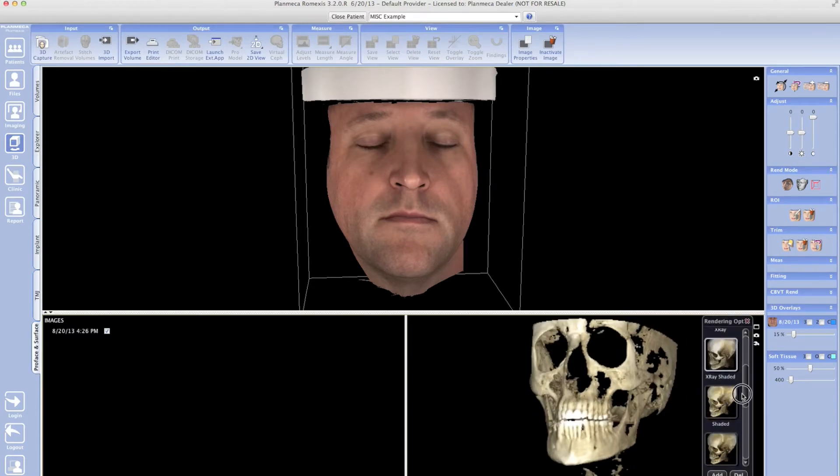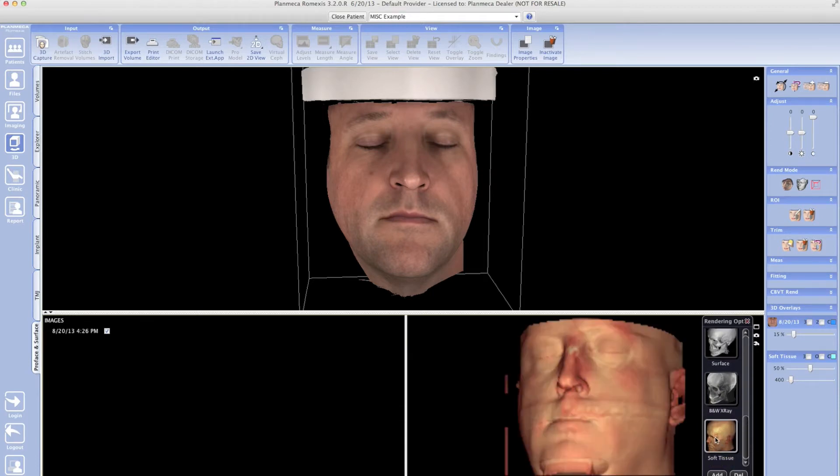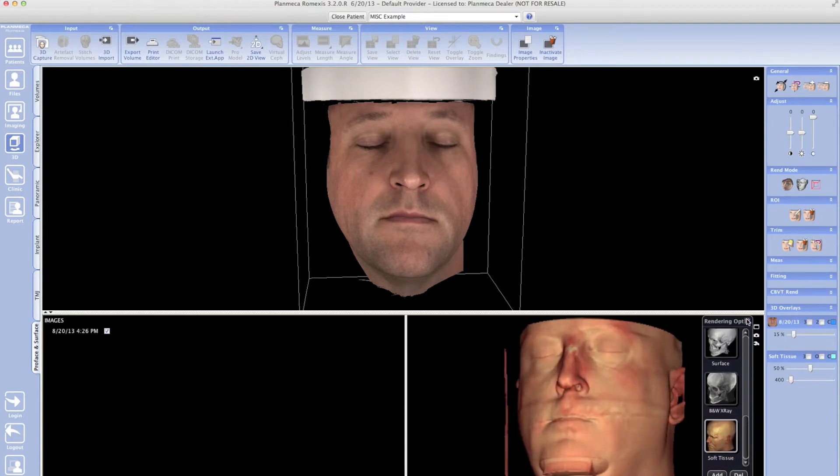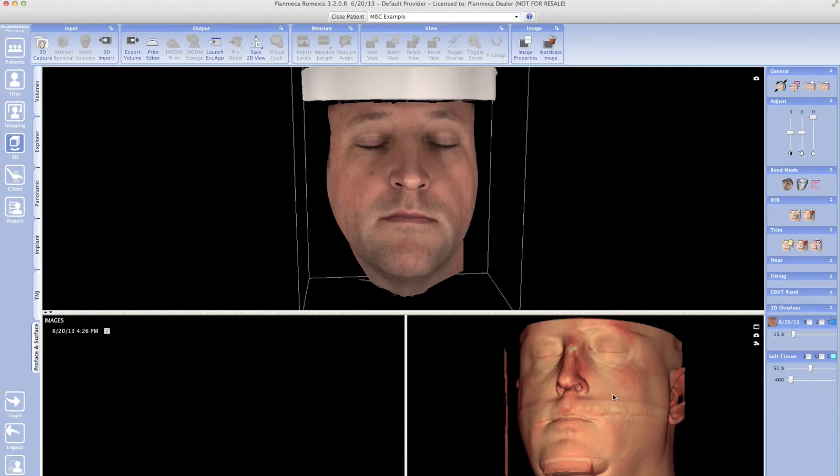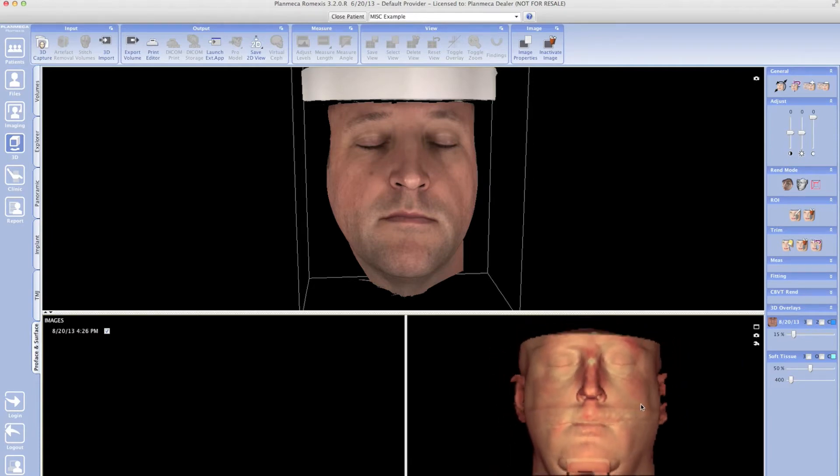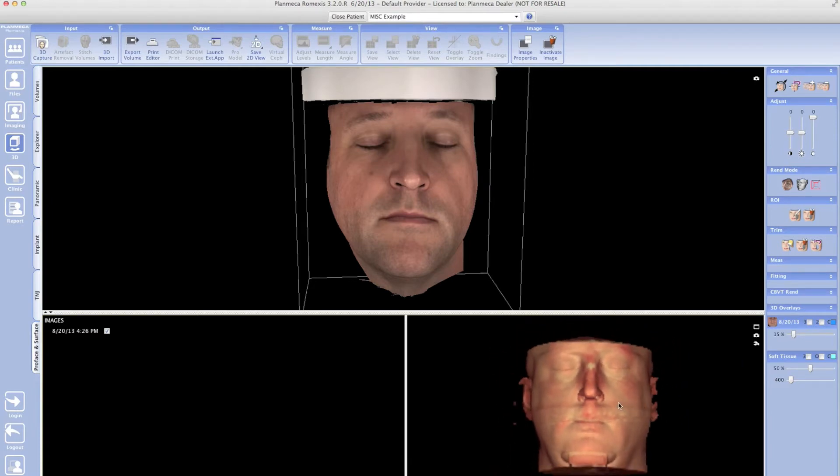Once I have that soft tissue view selected, I'm going to rotate that so it's facing me. Then I'm going to come over to the side and click on the fitting tab.